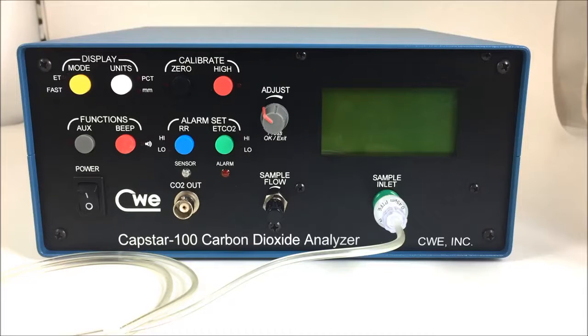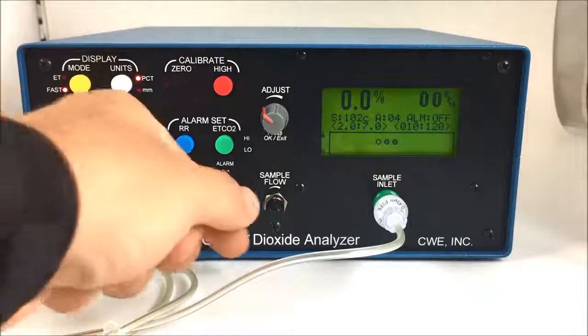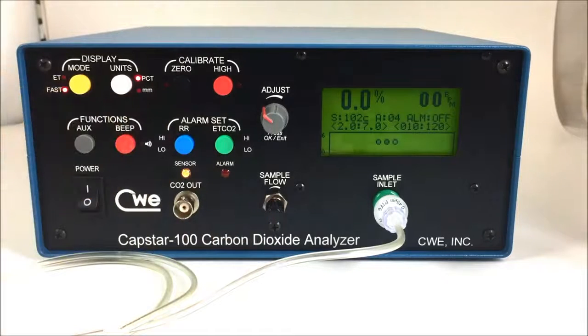In this video, we'll be going over the preferred calibration method for the CWE Capstar 100. As we begin our calibration procedure, we want to ensure that the unit is in fast, percent mode, and that our sample flow is close to the sample flow we intend to use for our study.